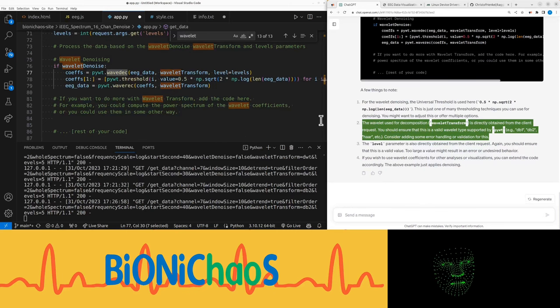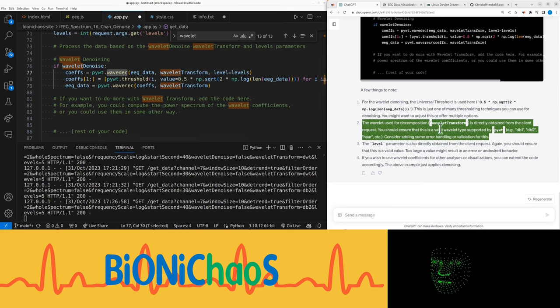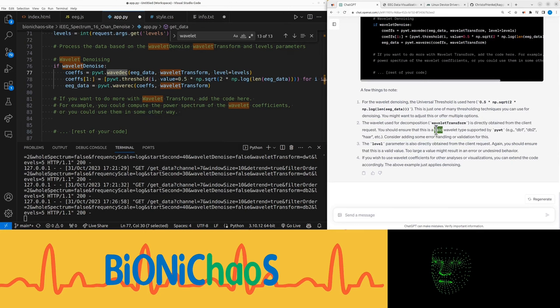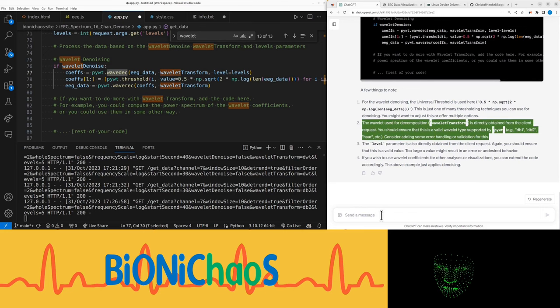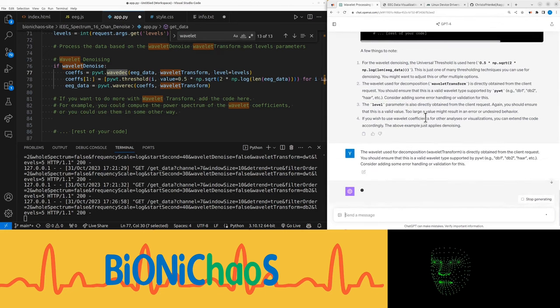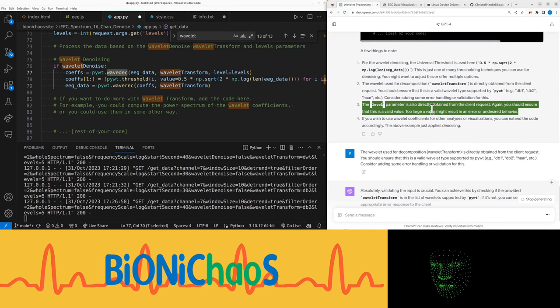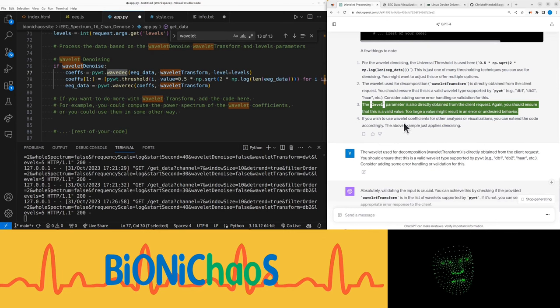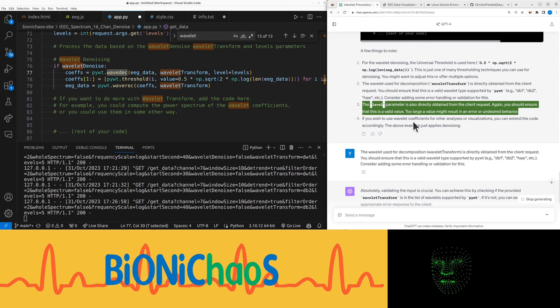The wavelet used for decomposition, wavelet transform, is directly obtained from the client request. You should ensure that this is a valid wavelet type supported by PyWT, e.g., DB1, DB2, etc. The level parameter is also directly obtained from the client request. You should ensure that this is a valid value. Too large a value might result in an error or undesired behavior.